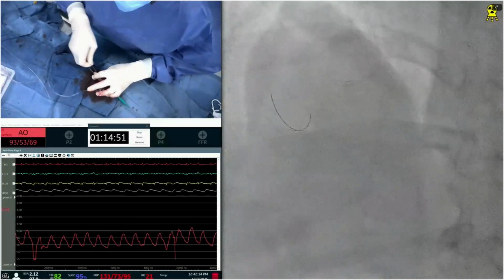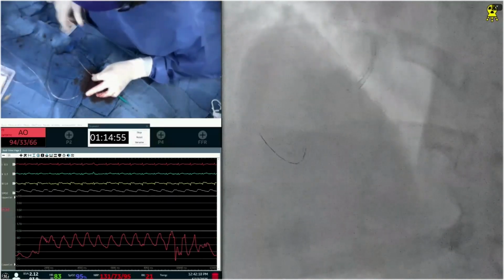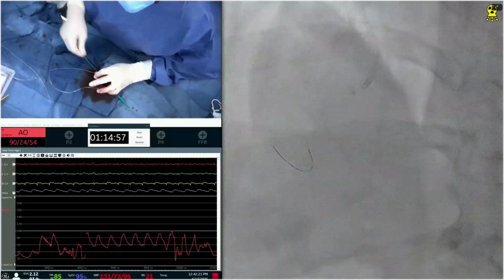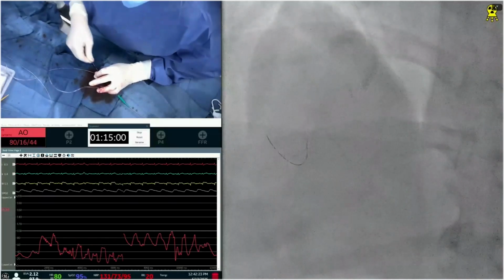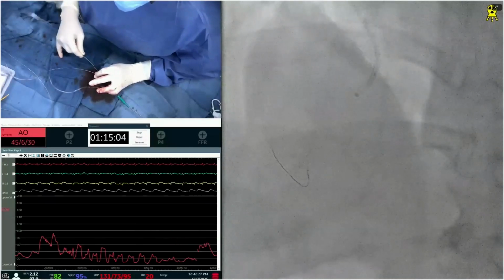Now we bring our Guideliner with Godzilla, and here we are going to do a smaller balloon. Yes, a shorter balloon. Not only a small balloon, but a new balloon, not the used one. Exactly. The earlier we had the used one. So same that you have to.